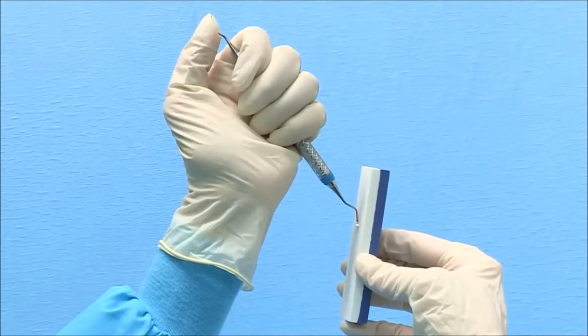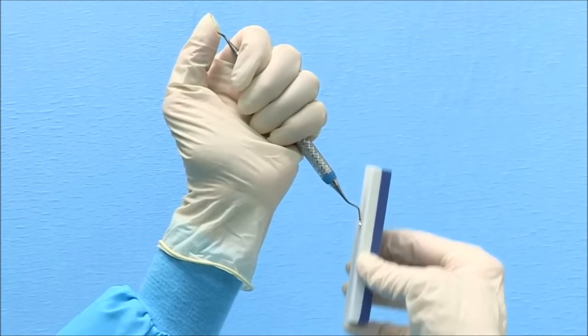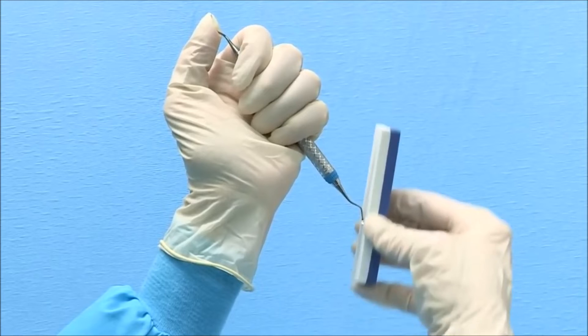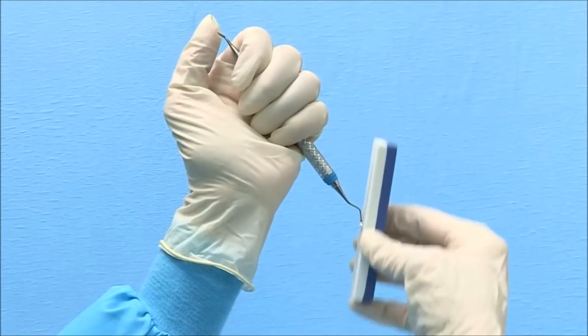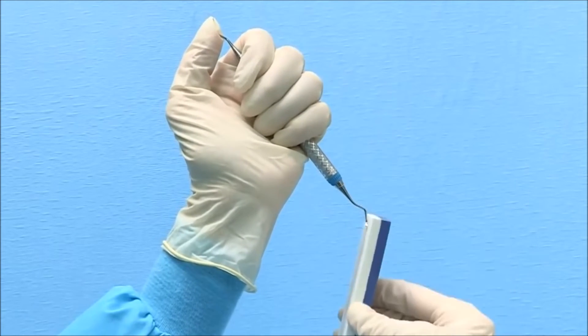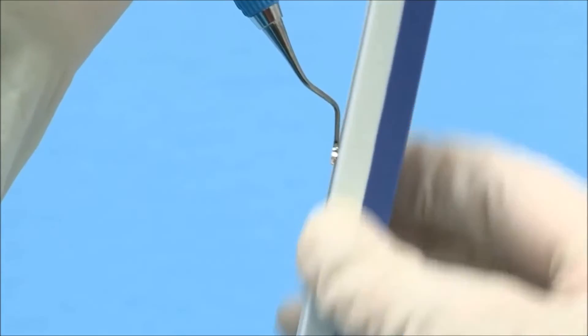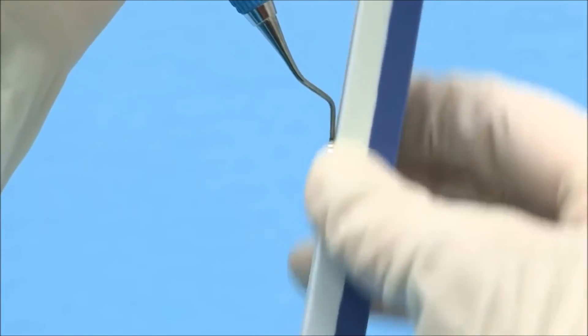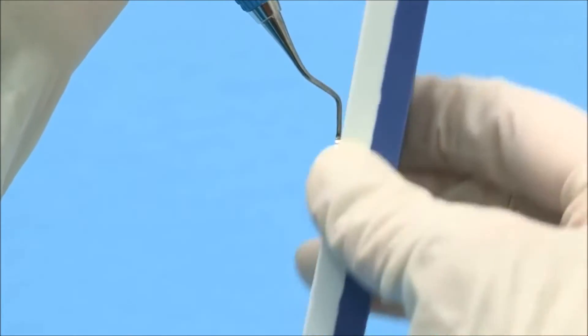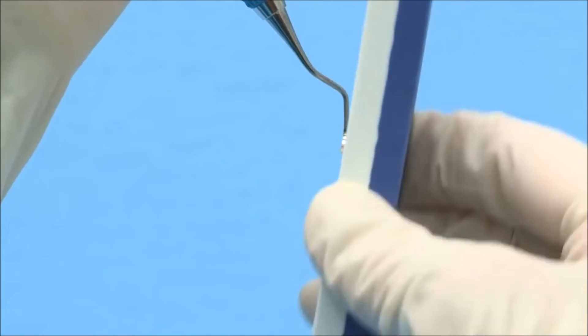Initiate sharpening in a fluid up and down motion starting at the heel third of the blade and slowly progress by moving the stone to the middle third and then finally the toe third. Maintain a continuous up and down motion using long strokes and moderate pressure. Finish on a downward stroke.